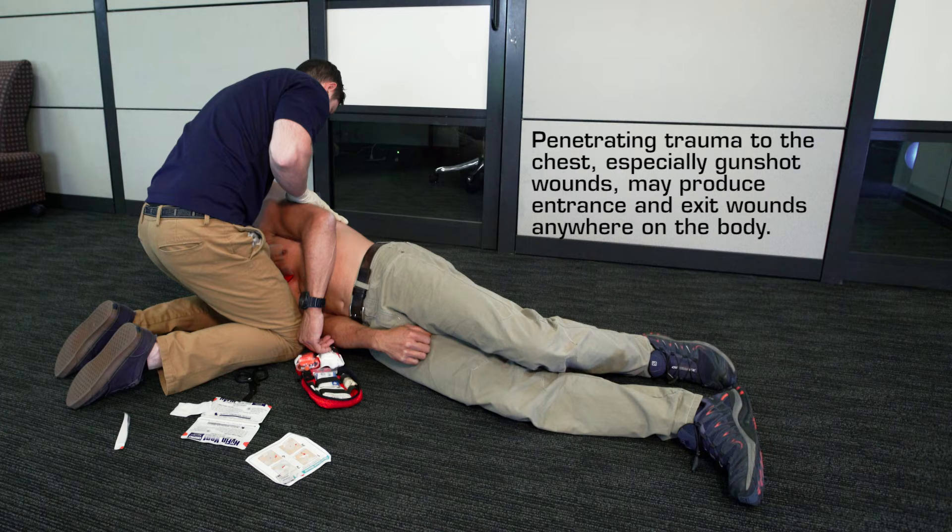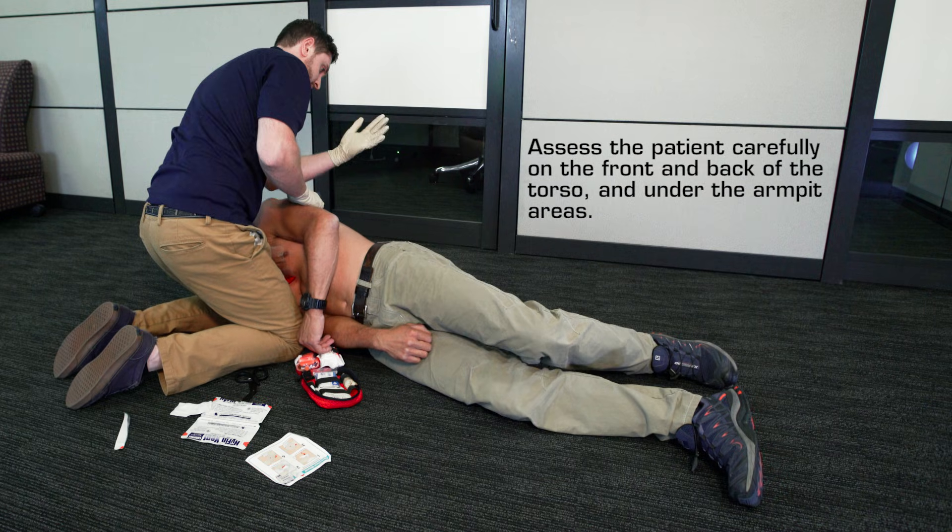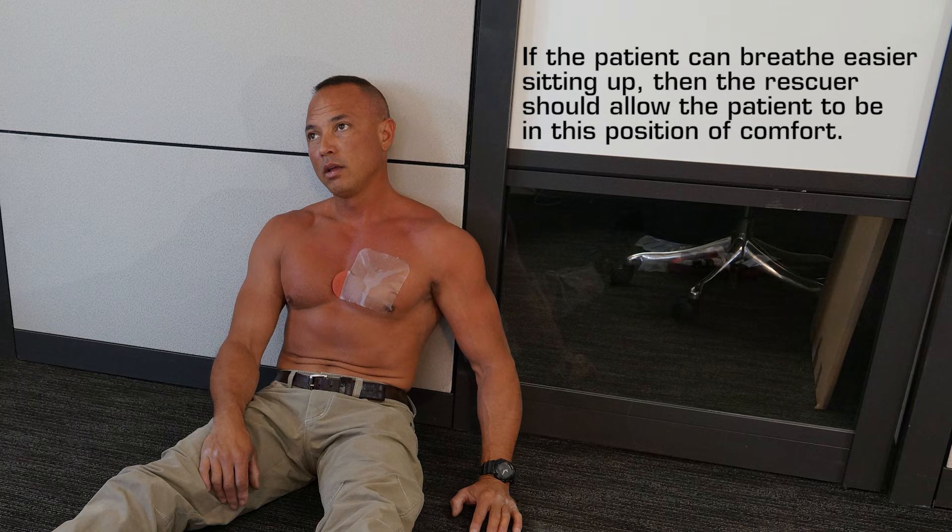Penetrating trauma to the chest, especially gunshot wounds, may produce entrance and exit wounds anywhere on the body. Assess the patient carefully on the front and back of the torso and under the armpit areas. If the patient can breathe easier sitting up, then the rescuer should allow the patient to be in this position of comfort.